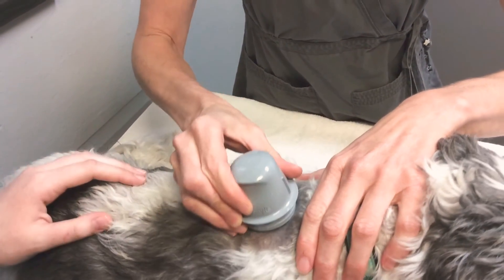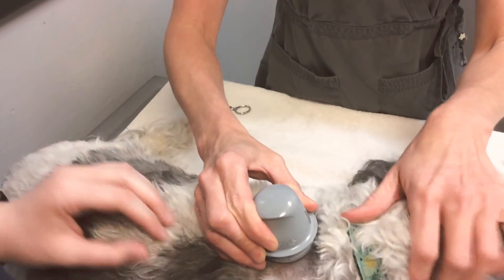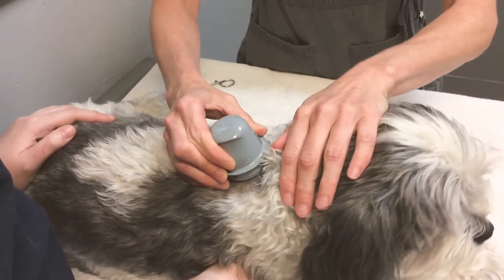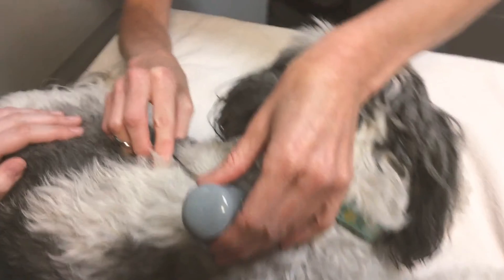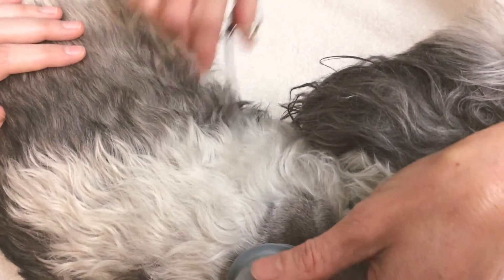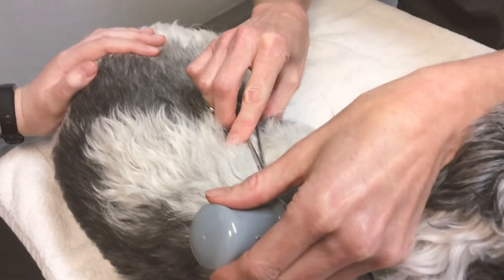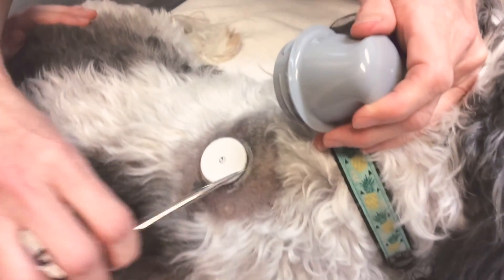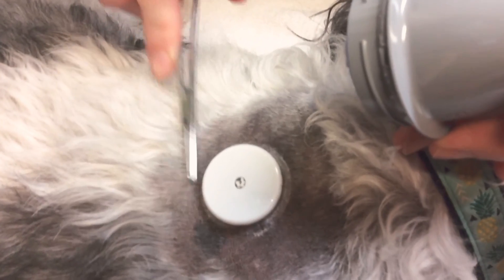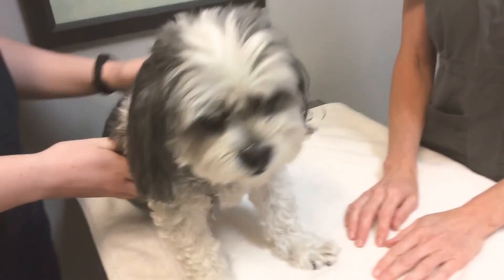When you place it over the furless area, you can hear it snap. I usually hold it for a minute and rock it a little bit. Now I'm going to take this, which will allow me to peel off the applicator. You'll see the sticky part — this little clear sticky part around the edge — and I just use these to help peel it off. You could also use some tweezers; not always necessary, but I like to have it. And now it's placed, and that's it.